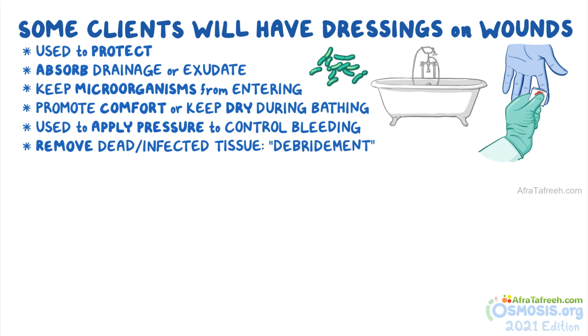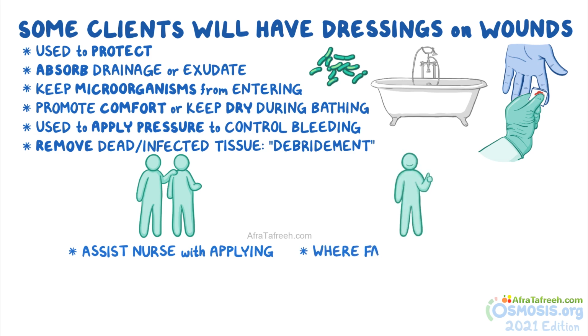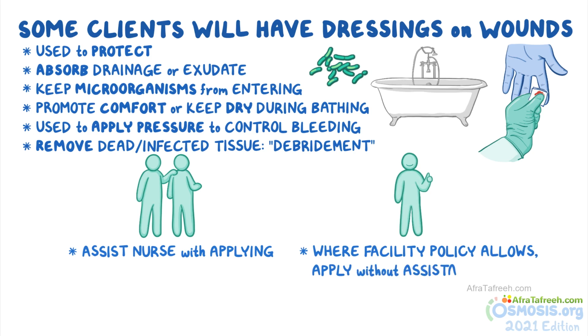As a nursing assistant, you will have the opportunity to assist the nurse with applying dressings or bandages, and in the cases where your facility policy allows, you may be asked to apply dressings and bandages for some clients without the nurse's assistance.